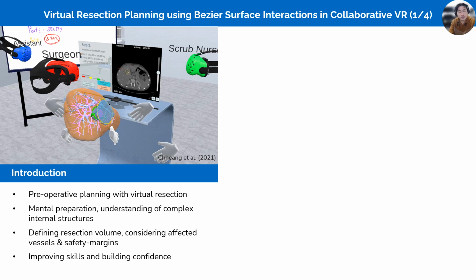Preoperative planning with virtual resection can support surgeons in mental preparation, understanding of complex internal structure, defining the resection volume, considering the affected vessel and safety margin around the tumor, and more importantly, improving skill and building confidence during the intervention.